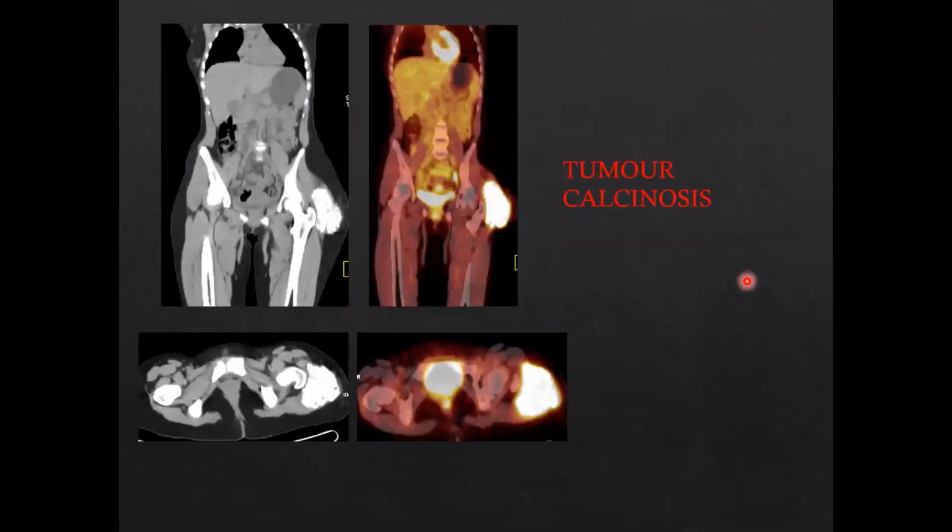So, coming to tumor calcinosis, this is something very surprising. This is a calcified tumor calcinosis component, but still it will show a significant amount of uptake because of the activity within the tumor calcinosis cells.